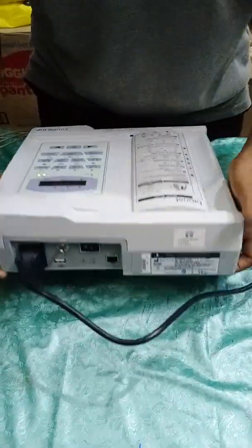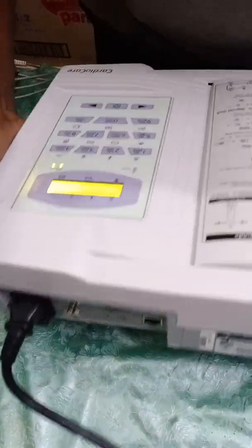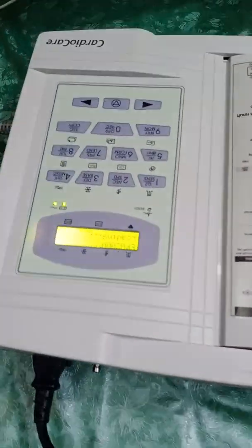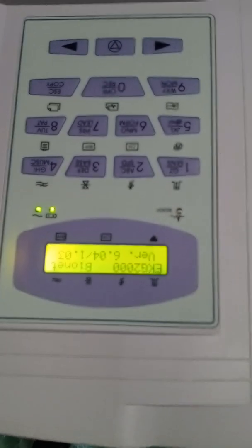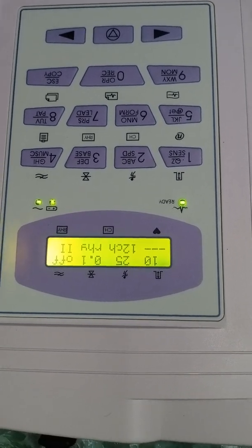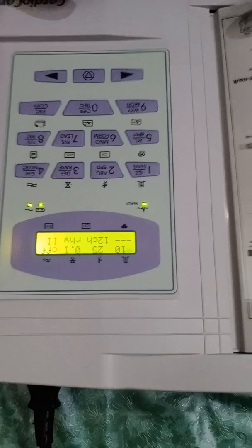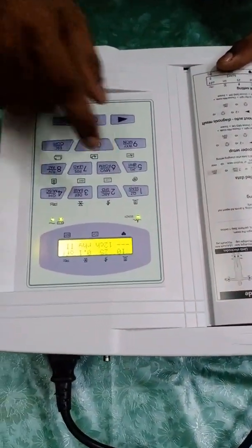This is the on/off button. I am switching the machine on. It is loading. There are many settings and features available in this BioNet machine — let's go through them one by one.